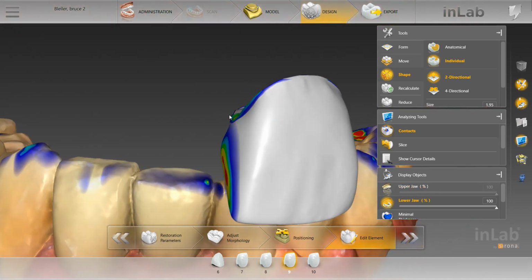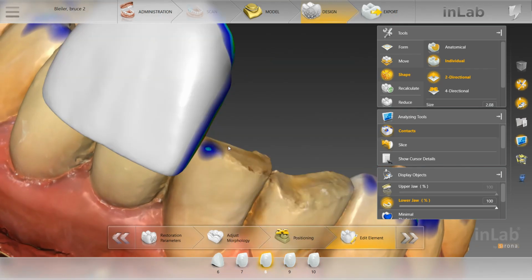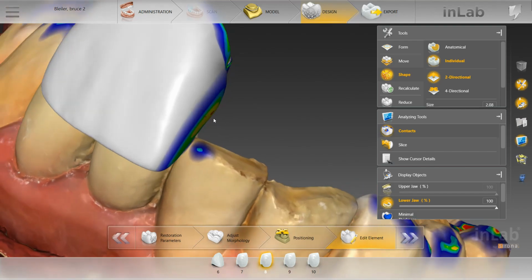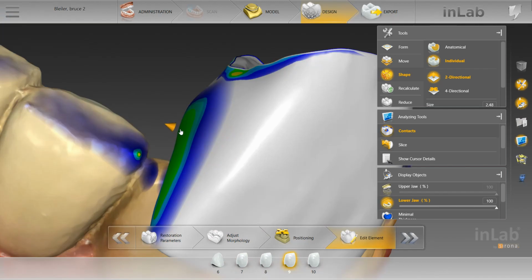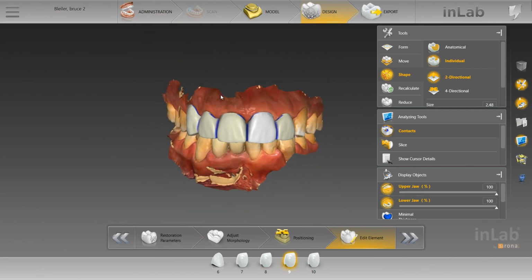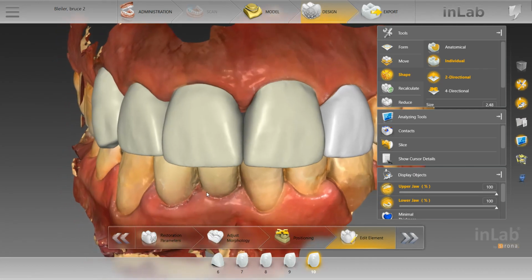Then we'll take away the jaw again. So there's contact, but it's straight. So we're gonna look at it from this angle, look at it from this angle. This doesn't look straight after you take away the jaw. So we'll make this green right here. Bring that slightly in. Then we'll go to number 9 and bring that in. And now let's look at our midline. Take away the contacts. Always take away the contacts to evaluate. And we're good. It's as simple as that.